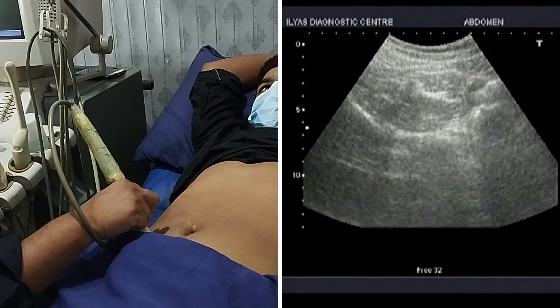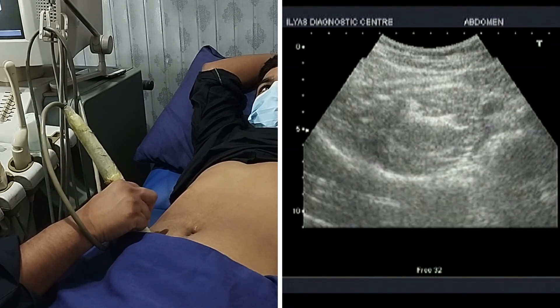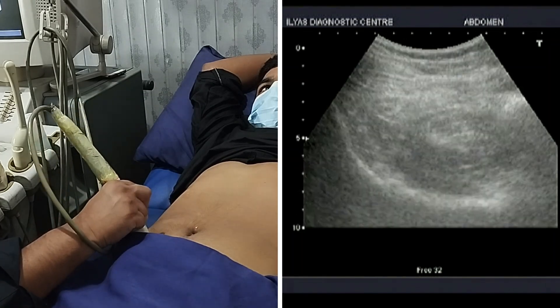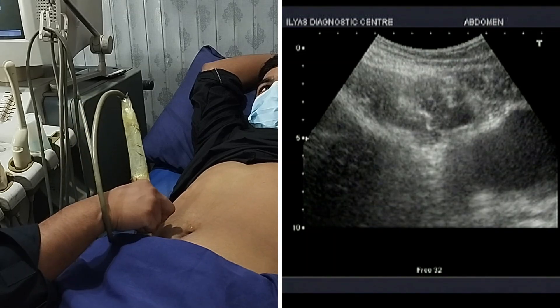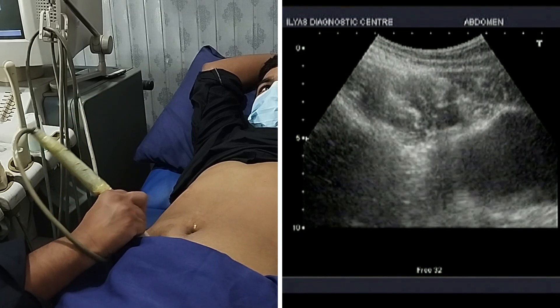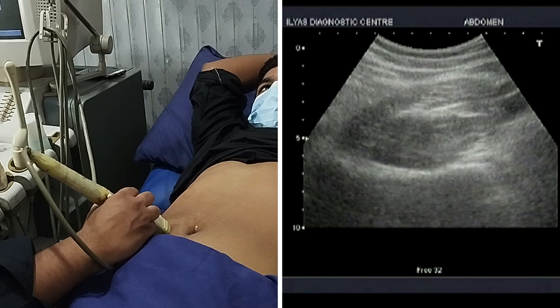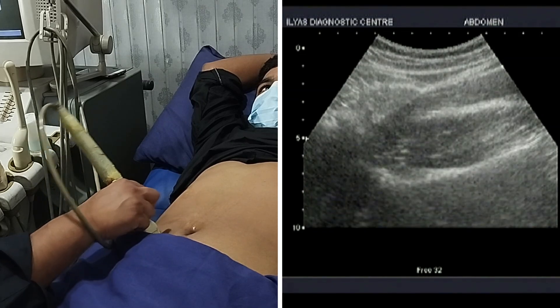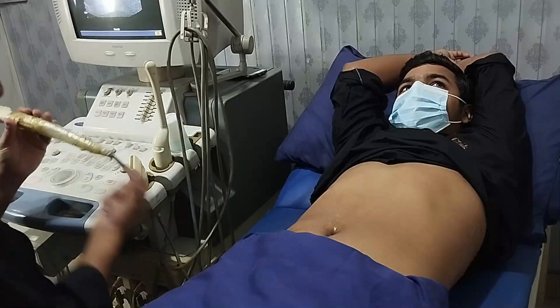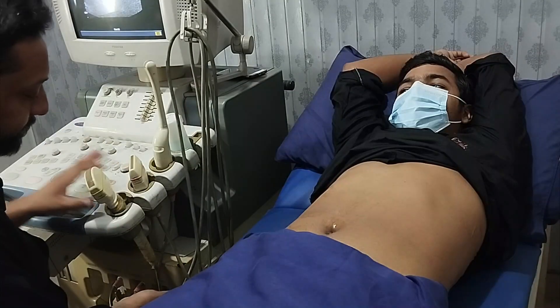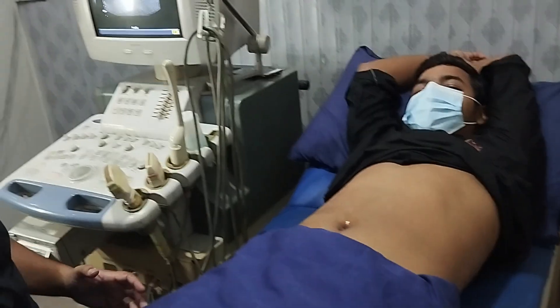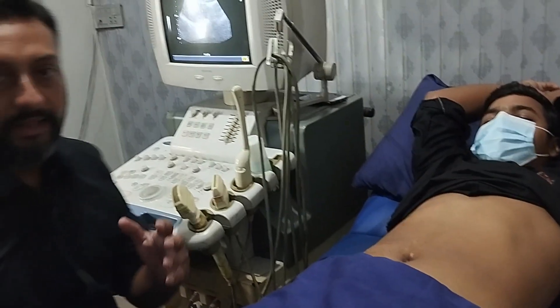Then coming to the last point, I usually evaluate the right iliac fossa especially for evaluating the appendix. Focus the right iliac fossa, put your probe here, and evaluate with both the linear and the curved probe approach. In this way we can complete our abdominal ultrasound in 5 to 10 minutes.